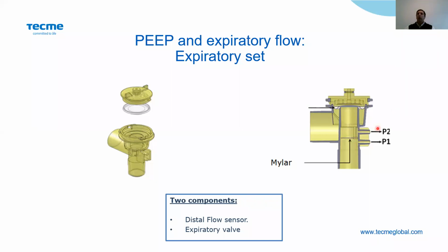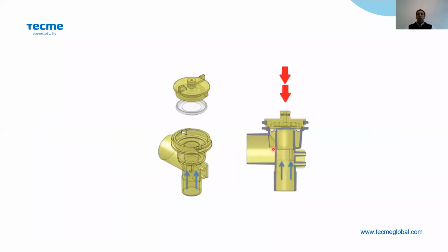So during the initial calibration, the machine will not be able to measure the volume and the expiratory flow and will not allow you to continue with the calibration. So basically here we have the two functioning.